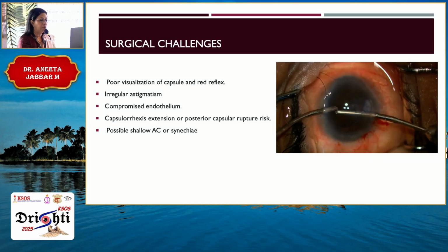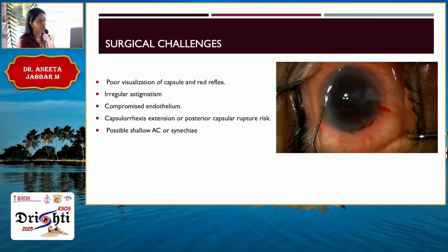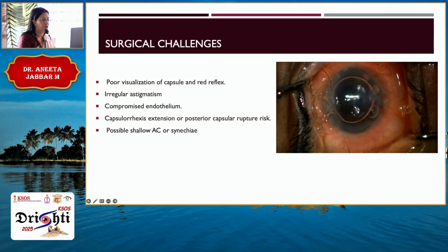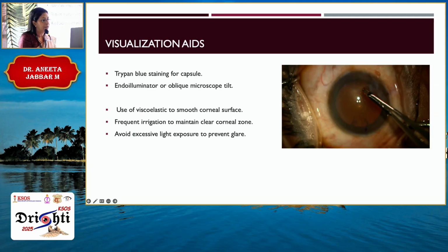Only thing, they have to withdraw the scleral contact lenses for a week or so. The patient was finding it very difficult without the sclerals because of the lid margin keratinization, which recurred again in spite of a mucous membrane grafting of the eyelid. So these are the surgical challenges.